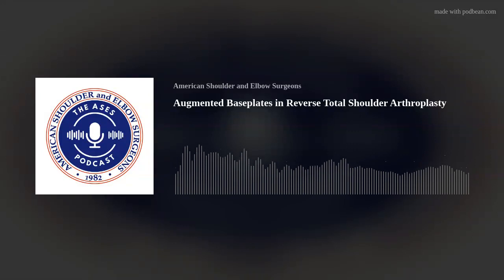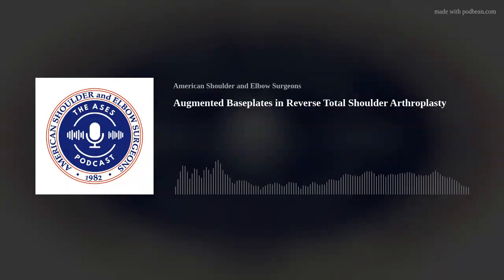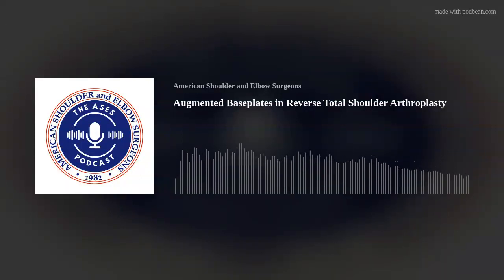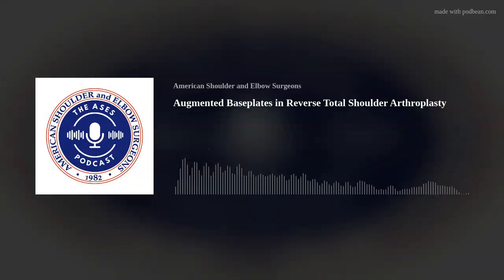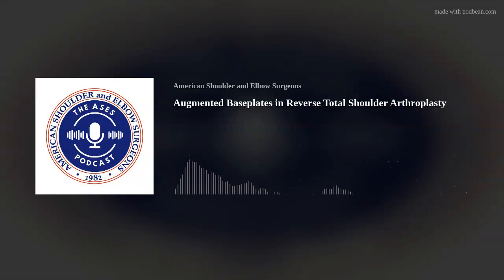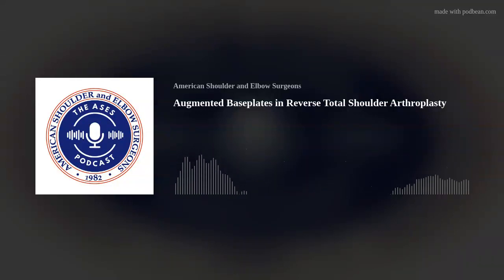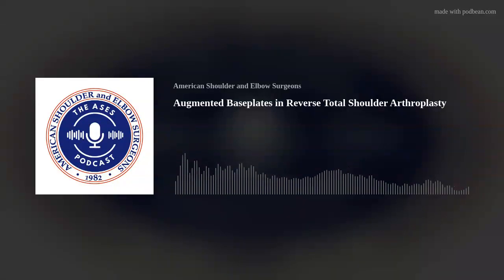Yeah, I agree with you. I think sometimes it's hard to be agnostic to your implant system, because there are going to be certain things that are afforded by your unique arthroplasty portfolio. We've definitely seen a transition towards greater utilization of metal augments, but Peter and I both trained under Greg Nicholson. Horseshoe grafts were very common, particularly with those eccentric wear patterns. So I'm curious, Andy, what are your thoughts on how you manage this scenario?